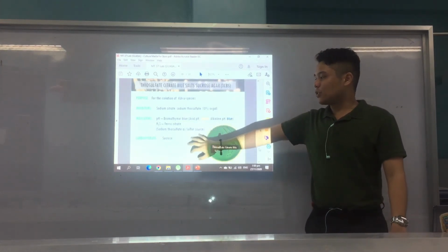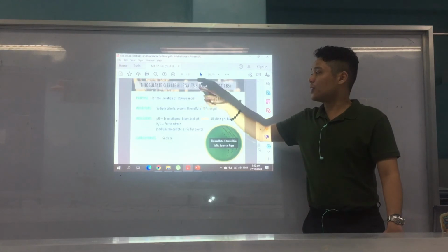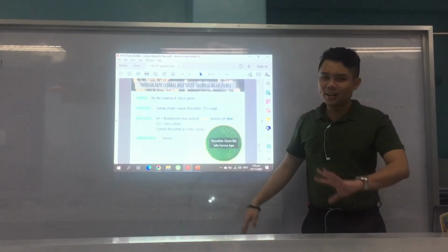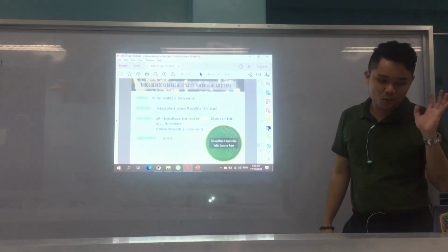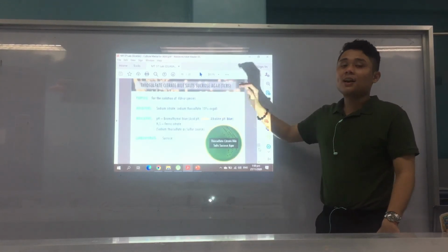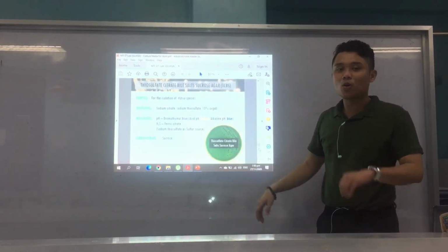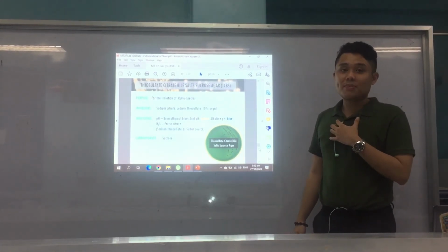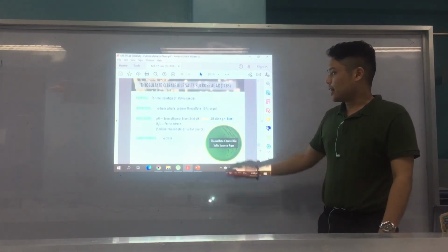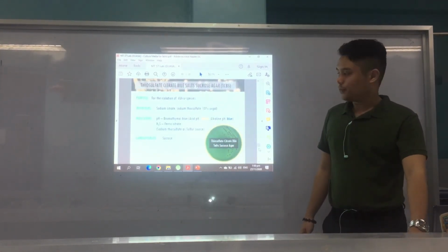Okay, alright. And the carbohydrate is of course sucrose. It's actually in the name, guys. Thiosulfate citrate bile salts are the inhibitors. And then sucrose is the sugar, right? So it can be confusing which are the inhibitors and which is the sugar. Alright? And again, who is this for? For Vibrio. Nothing else, guys. Vibrio, TCBS. But the enrichment media of choice for Vibrio, of course, is APW, alkaline peptone water. Okay. And again, please take note of the pH indicator, bromothymol blue.